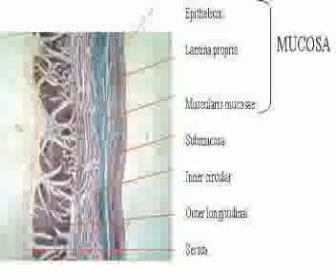This structure resembles the skin because it has similar stratified squamous epithelium with the skin. Its muscularis mucosae is not fully developed, but its muscular layer is very thick.